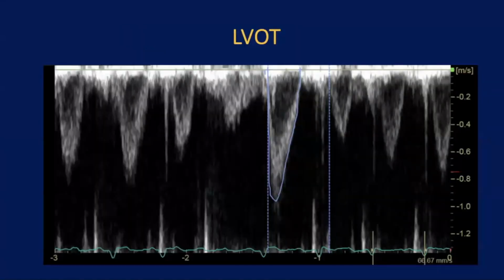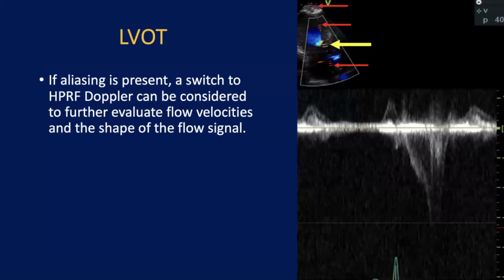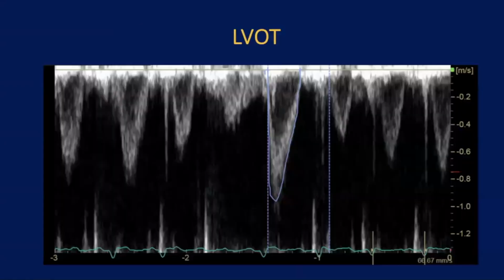Yeah, but over the last 15 years, what I noticed is that it actually caused more problems than it's worth. Because it does it automatically unless you switch it off on your machine. When you increase your velocity high enough, it goes into this mode, sometimes without you noticing. And the range ambiguity is the main problem. You don't know where the signal is coming from. So CW will be the answer.